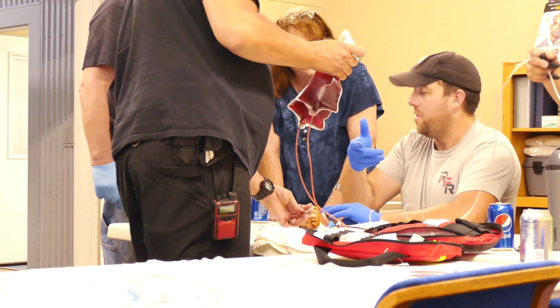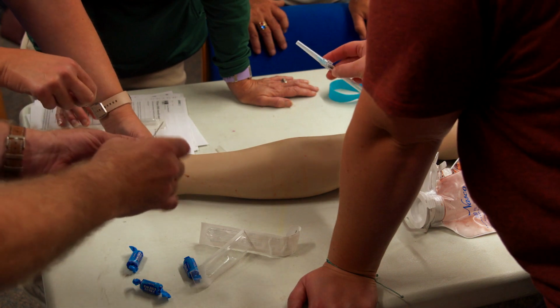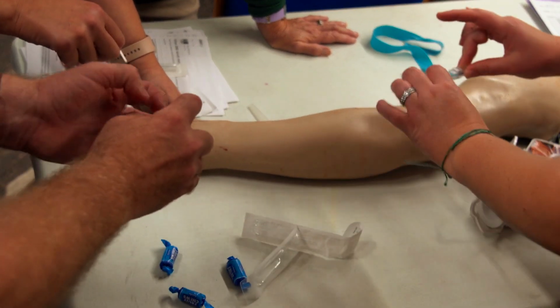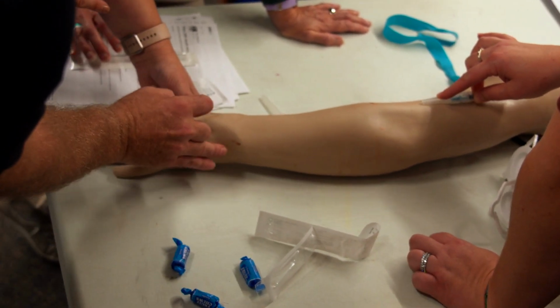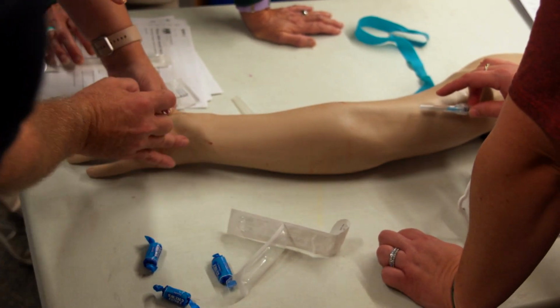So for me, I hold it like this, and then break that tab, pulling back pressure with that one, kind of pushing, so it's keeping this whole assembly together. Okay. And then your thumbs here, where do you want to hit? I want to hit like here. Okay, so just be sure we're going to come from the side, or enough angle so that we're not going across your really nicely painted nails there.